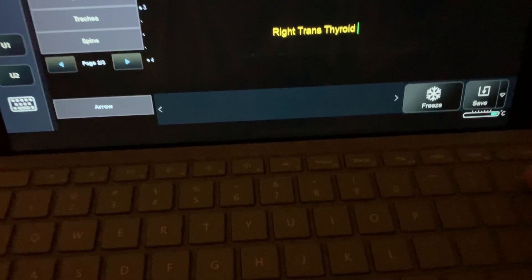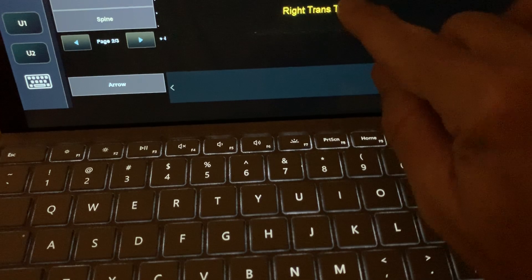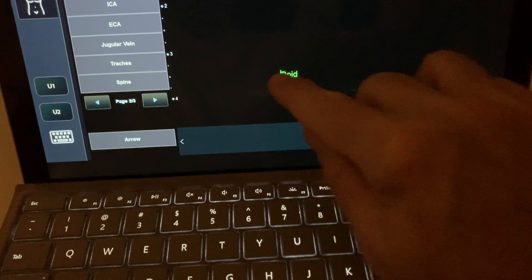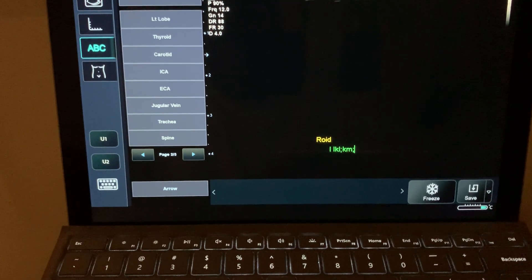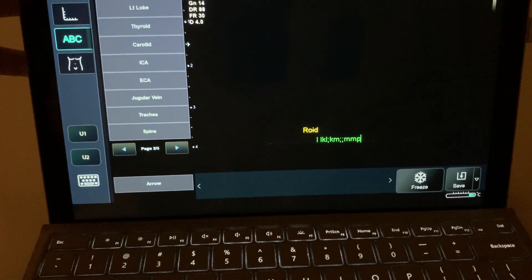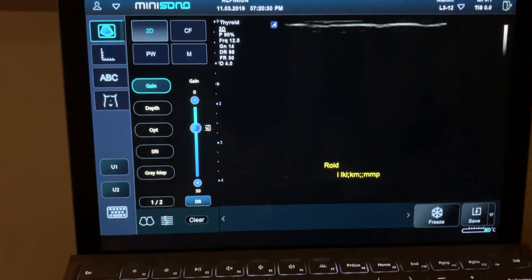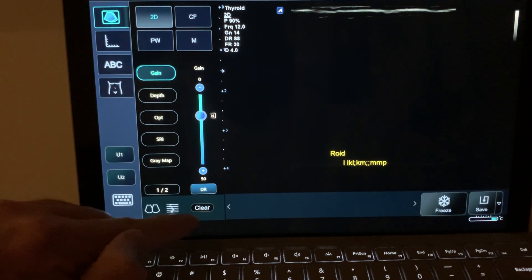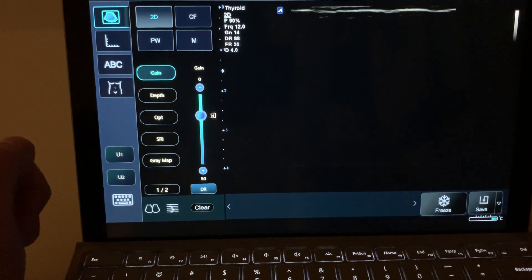If you want to type by yourself, you can also use the keyboard on the system — there's a backspace key to delete. You can type whatever you want there. To go back to 2D, click here at the bottom. To clear those annotations, in the lower side of the monitor there's a 'clear' option — click clear and you'll see the annotations go away.